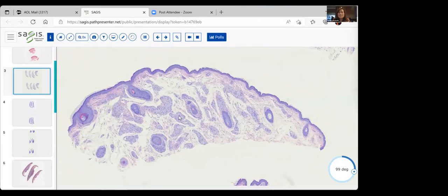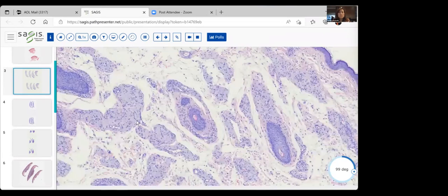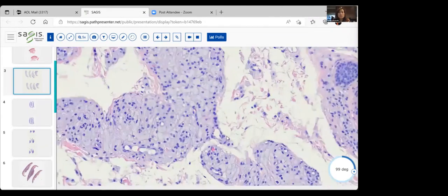And these histiocytes look a little different, don't they, from the previous histiocytes I've shown you. They don't have that pink cytoplasm that we were talking about. Let's look a little closer. You can see that these collections of histiocytes are lying free in the tissue. There's no accompanying fibrosis or sclerosis going on. They're lying in the tissues somewhat in a plate-like fashion. So going across the upper epidermis, the upper dermis, and you can see, let's get a little closer.